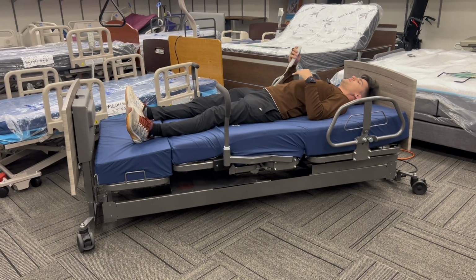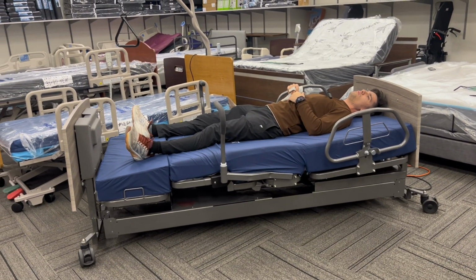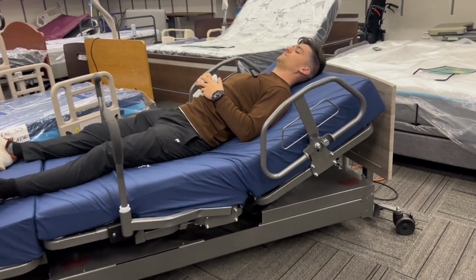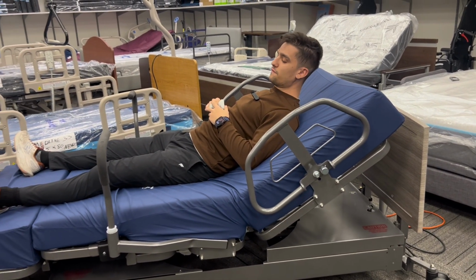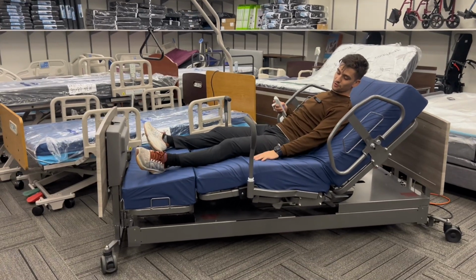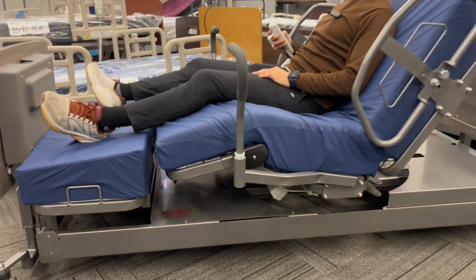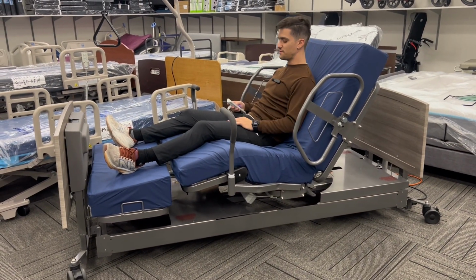So while I'm in bed, it does all the normal functions of a hospital bed. So I'm able to bring my head up almost to a full 90. I could stop it at any point, bring it to wherever I desire. The bed itself is also able to raise the knee section up as well. So I'm able to raise this knee section up. So I can bring myself to almost a seated position.